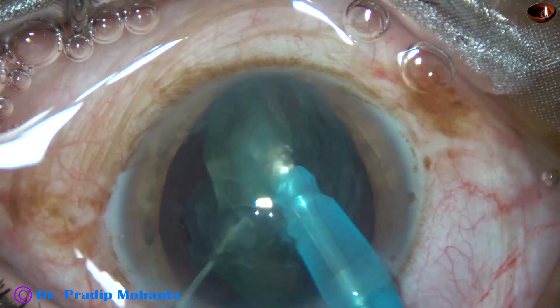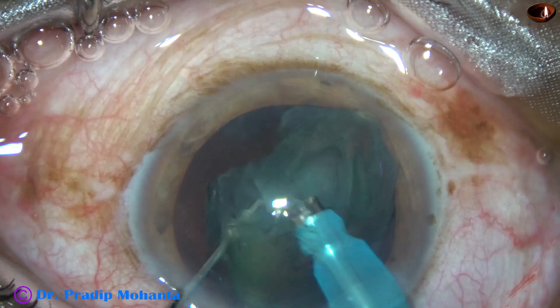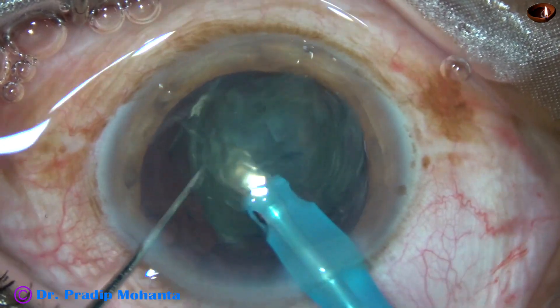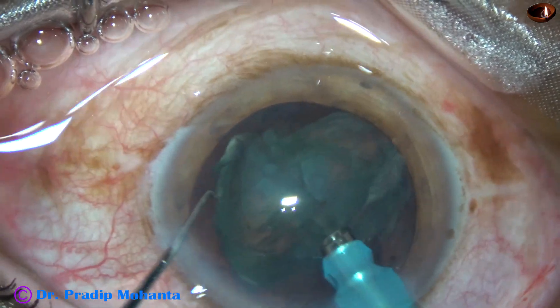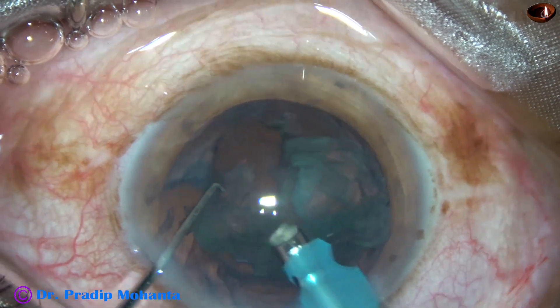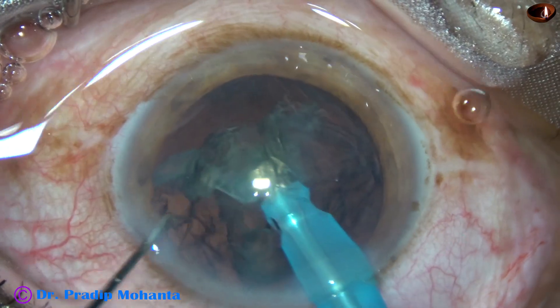This is cracking the rest of the nucleus. And the front portion is emulsified. This is the other piece. Most of it is removed. And now this is the last portion.